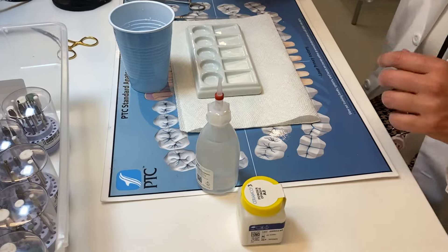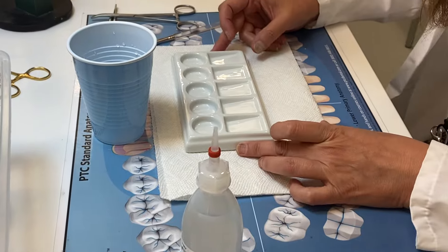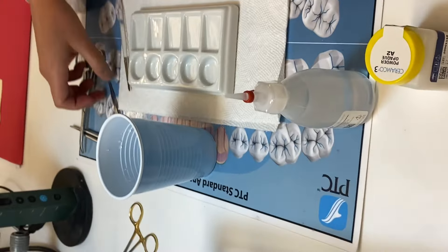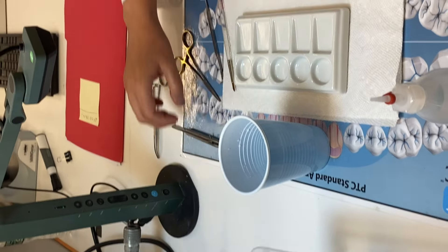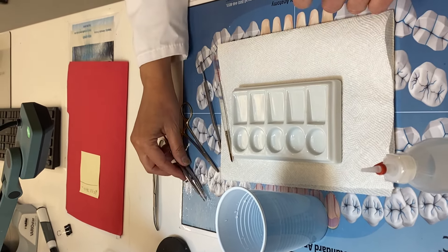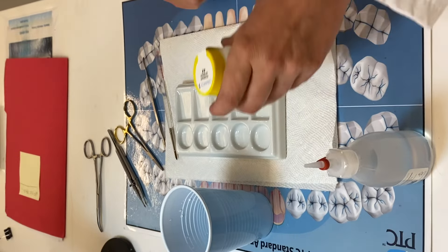So what you need for opaquing: you need a tray, a small brush, a mixing instrument. You can use a hemostat or a college plier or a holding plier for holding your framework.